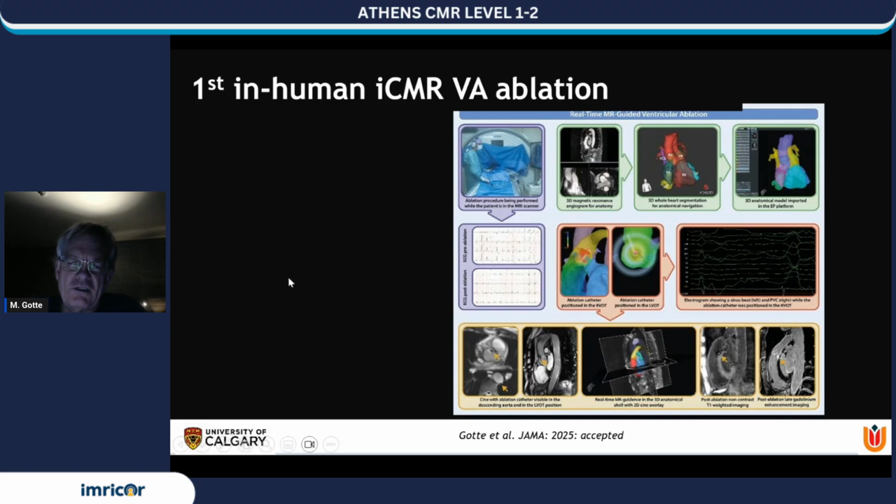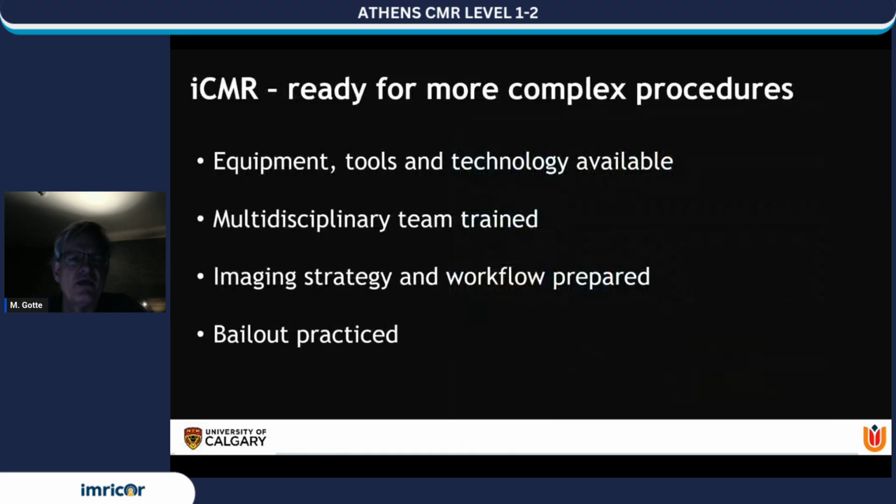And we look with confidence to the future to do the first transseptal left-sided ablation procedure. So we think, with the overview of all the tools and all the talks of today, that the equipment, tools, and technology are available. The multidisciplinary team is trained. If someone else wants to start doing interventional procedures, we are also willing to help you train the team.